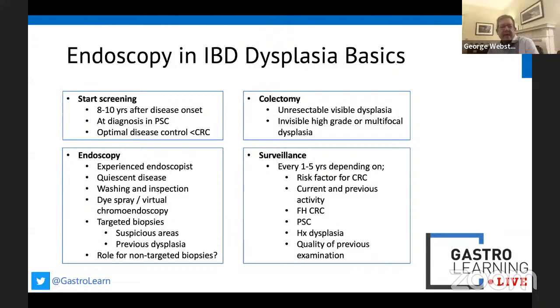Okay. And as part of surveillance for dysplasia, the days of non-targeted biopsies are long gone? Yeah, again, that's one of those things that's come and gone. In my practice, and I think most people's practice, and I think what BSG recommend, is that you do a high quality endoscopy, ideally with narrowband or dye spray with a high definition scope, and you take targeted biopsies.